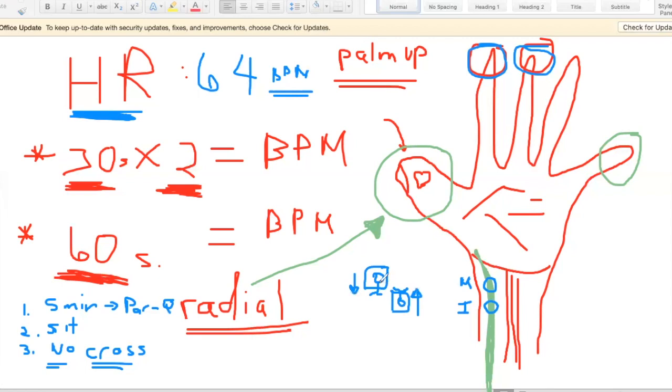Now, what that does is it makes it so that this arm on this side can palpate this arm of the subject. But if I put the chairs kind of like this in front of each other, then my legs are in the middle of my subject's legs, and it's kind of awkward. So I establish a working environment here so that I'm side by side, and this person can move this chair up as far as they need without crashing into that person. So it's just a little bit of a subtle change in the way the environment is set up.